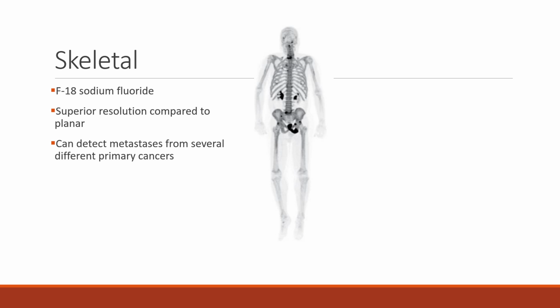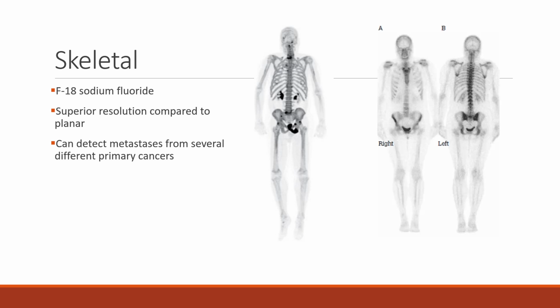And remember that this is done with PET CT, and you have a lot better image quality. The second image is a bone scan using MDP or HDP. You'll notice that you don't see nearly as much activity. Even though it still has a good target to non-target ratio, the images are a little noisier. You see a little more body background and things like that. It's just not a sharp, crisp image.